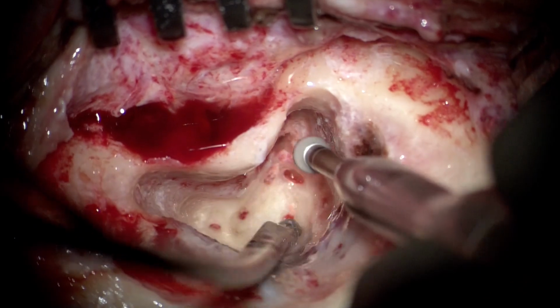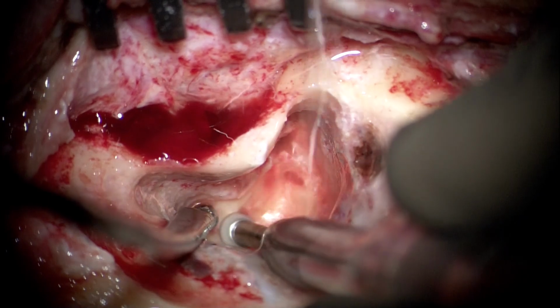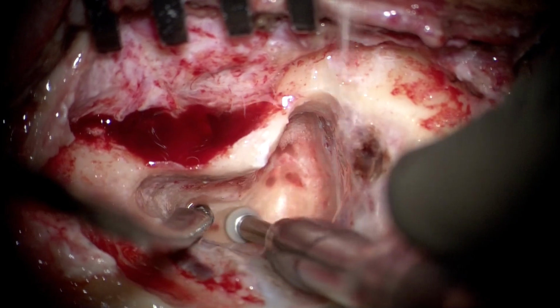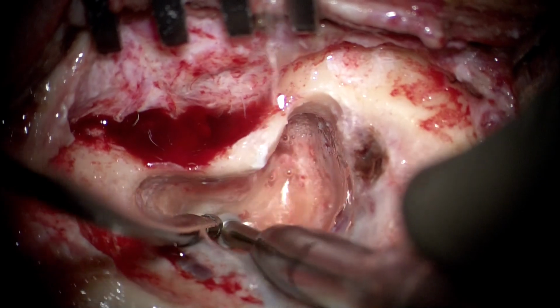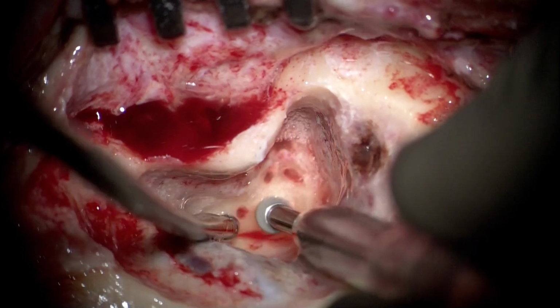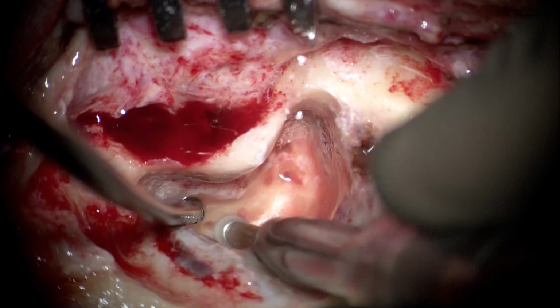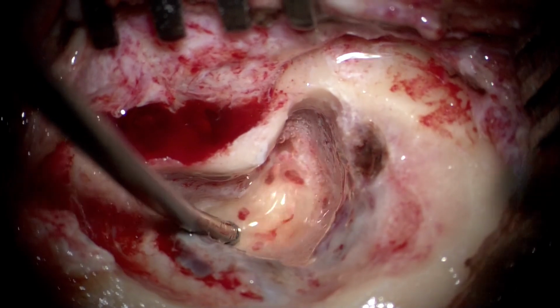As we drill towards the superior canal more, we see our subarcuate vessel still bothering us just a little, and like I said before, it has to be coagulated from time to time. Like I said, we have to definitely identify the posterior canal ampulla, because that's our inferior limit of drilling. The surgery would not be over till we do so, because only then can we expose the vestibule completely.